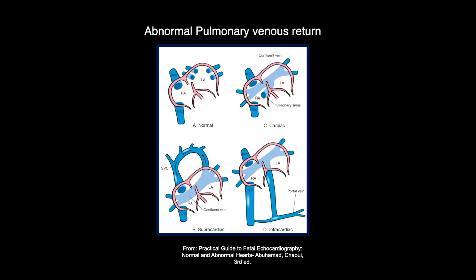So the next question is, where are these veins going? Right, so we know that they can return above the heart, coming behind into this confluence, and then draining through a vertical vein up, and then more commonly draining into the innominate and into the SVC. Also can go below the heart.